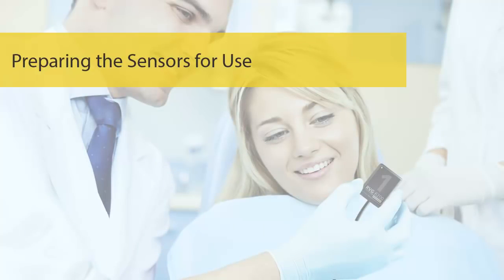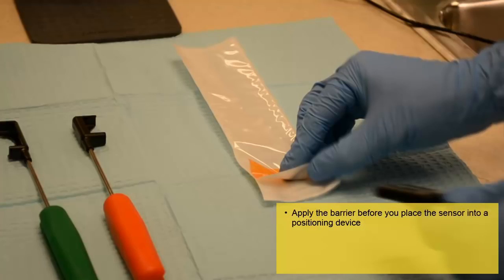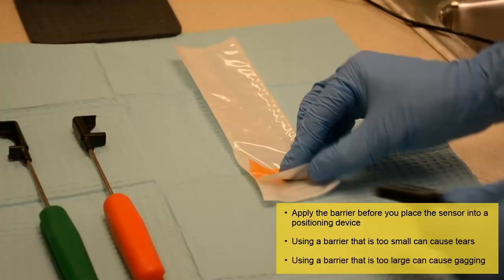Preparing the Sensors for Use. You must cover the sensor with a barrier prior to use. Apply the barrier before you place the sensor into a positioning device. If you need to change positioners during use, you do not have to reapply a barrier. Select the appropriate barrier size — using a barrier that is too small could cause tears, which can contaminate the sensor, while using a barrier that is too large can cause discomfort to the patient and can trigger a gag reflex upon placement.